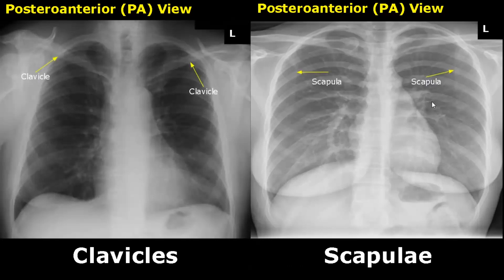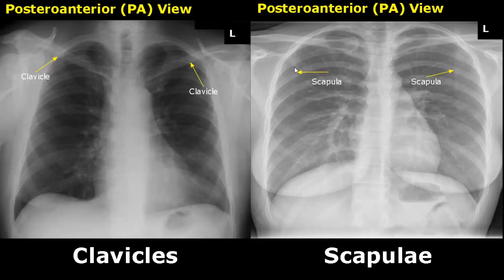The clavicles, also known as collar bones, will be superimposed over the lung apices. The scapulae are seen behind the ribs and they are triangular shaped bones.